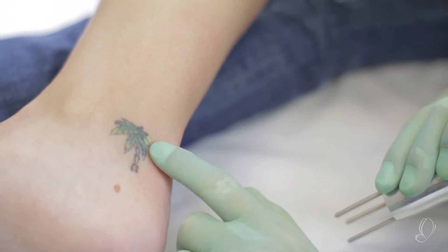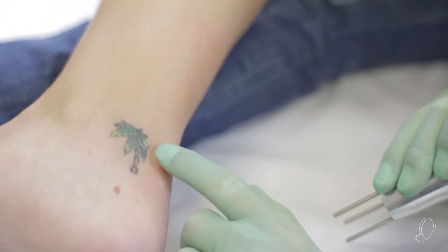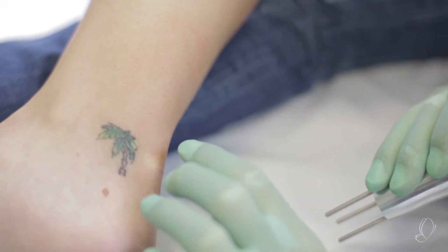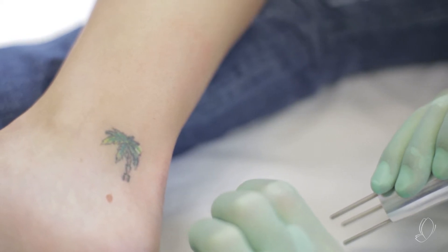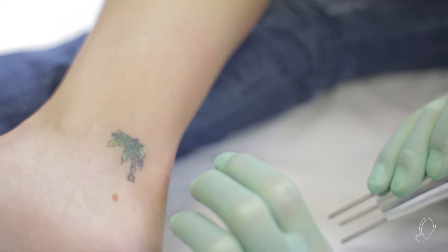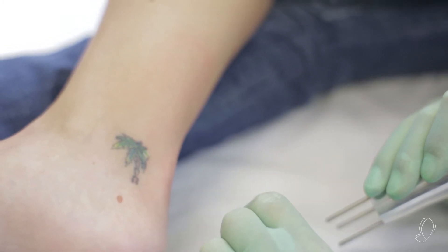And so that's why it's so important to have multiple wavelengths when you're doing tattoo removal because you really need those multiple wavelengths to get all the colors of the ink.